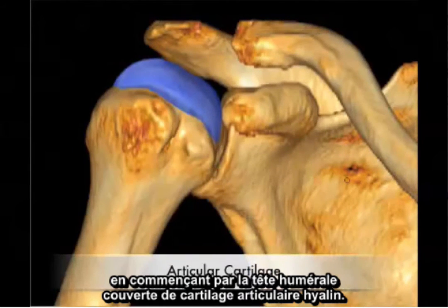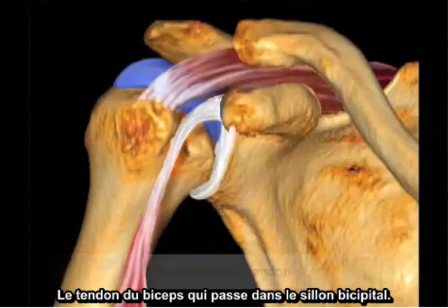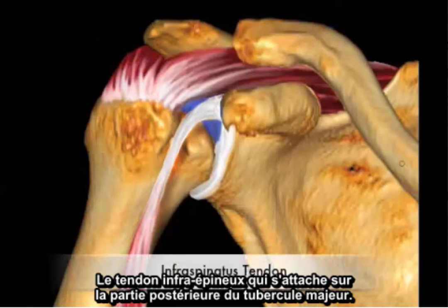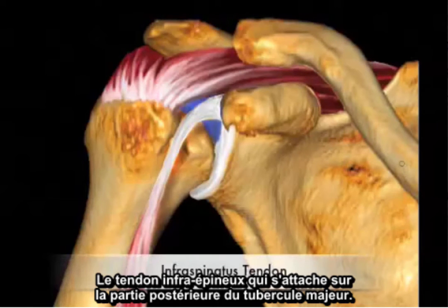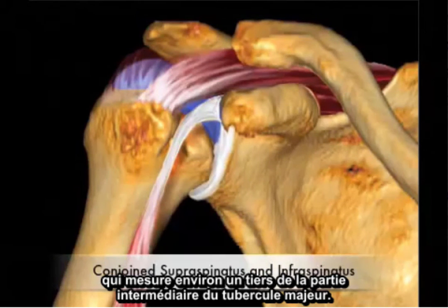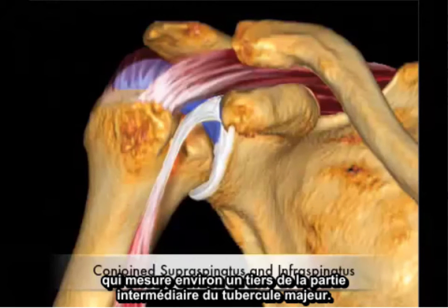Starting with the humeral head covered by articular hyaline cartilage, the bicep tendon as it passes through the biceps groove, the supraspinatus tendon as it attaches to the anterior aspect of the greater tuberosity, the infraspinatus tendon as it attaches to the posterior aspect of the greater tuberosity, and the conjoined portion of the tendon, which makes up approximately one-third of the middle aspect of the greater tuberosity's footprint.